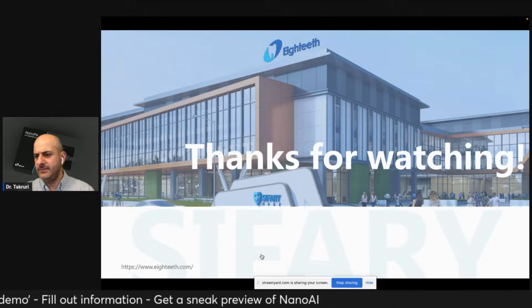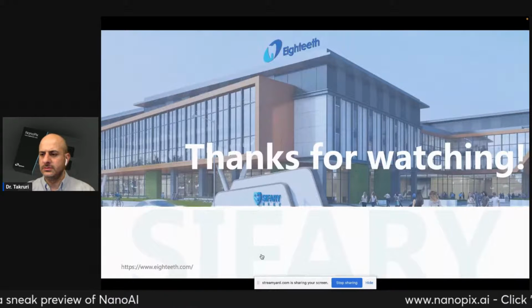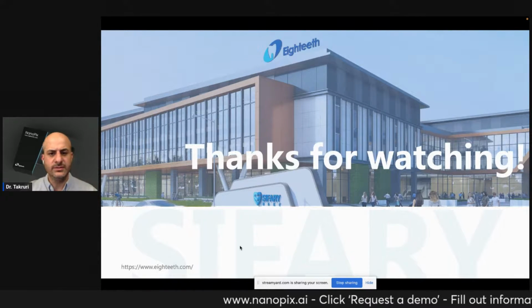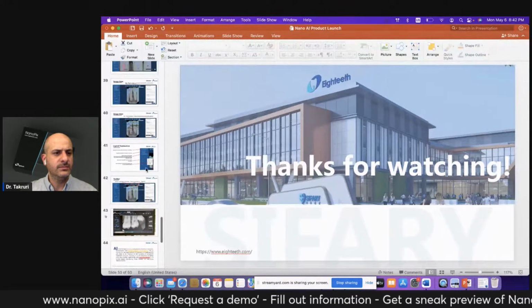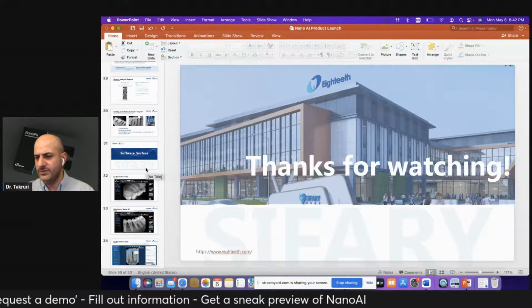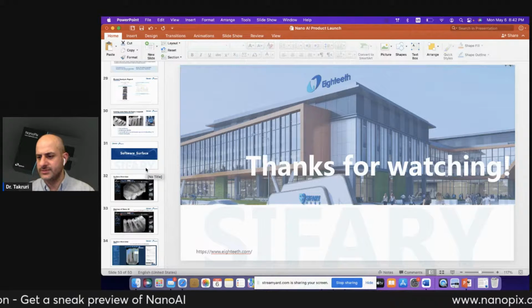How to add the clinic name in the report? I have to check here if we can add it or not. But I think, yes, it's something you can add, but the team can help you on this, or your distributor can guide you through this.